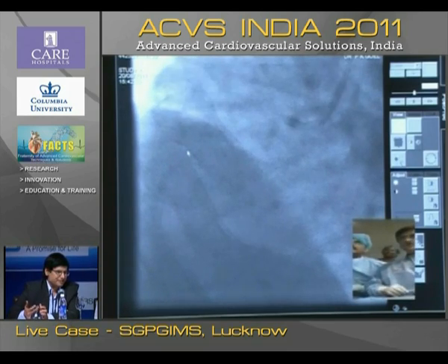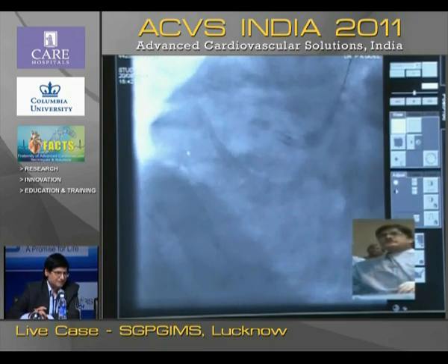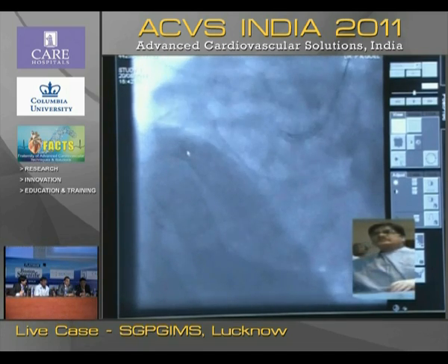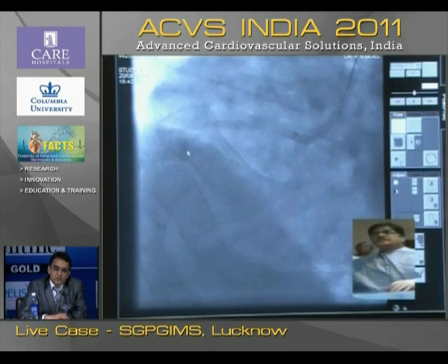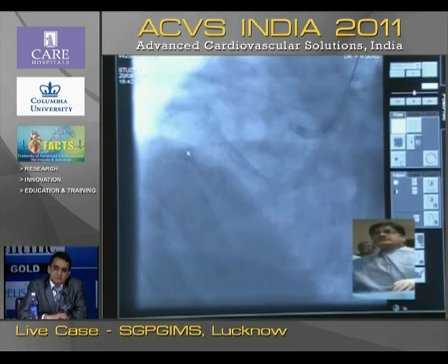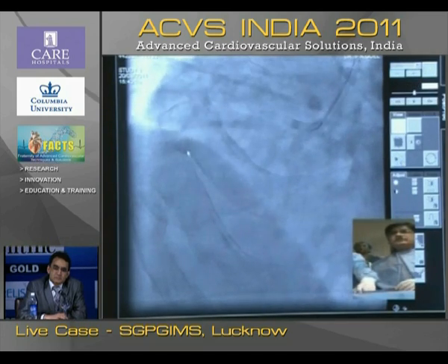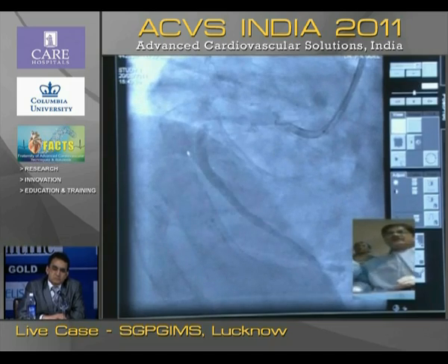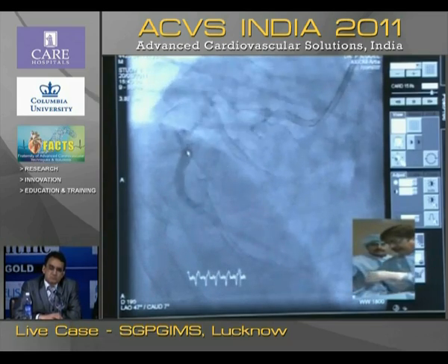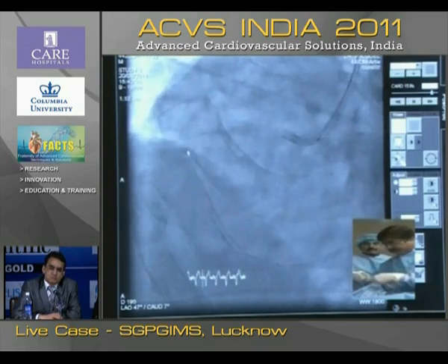I agree on that. Of course, you can take extra support by taking a micro catheter, and you can probe with a hydrophilic Fielder XT whether micro channels are present or not. Dr. Goel, would you give a test shot now and see what is the effect of the earlier wire passing? Inject. Come on. No, there's no channel that I see. Anyhow, I am trying a Fielder XT, and I will not be too persuasive on that, and soon I will change to a Conquest if this doesn't go.